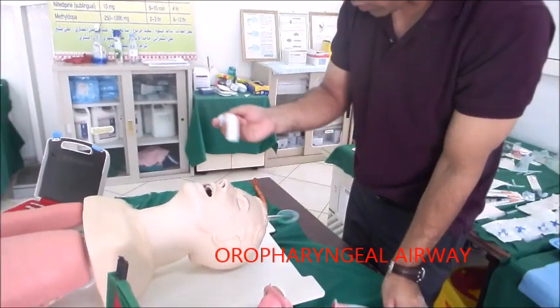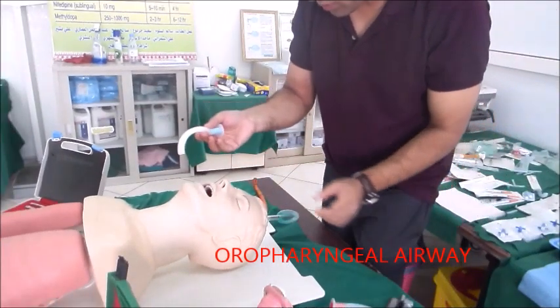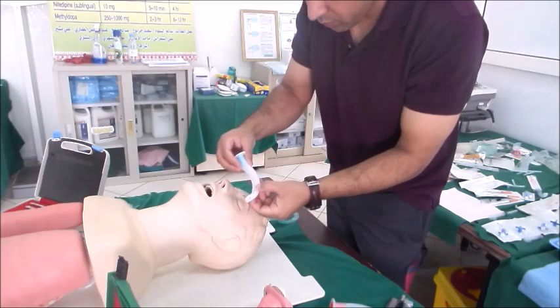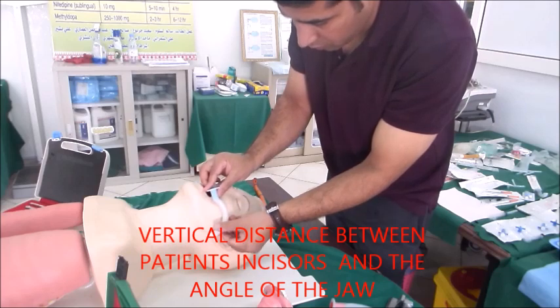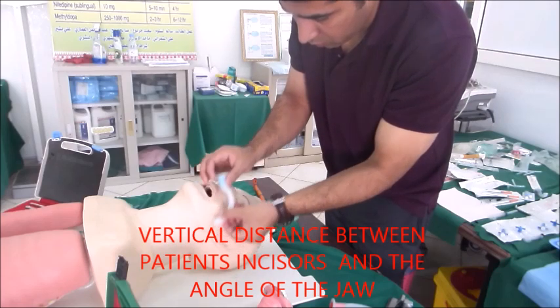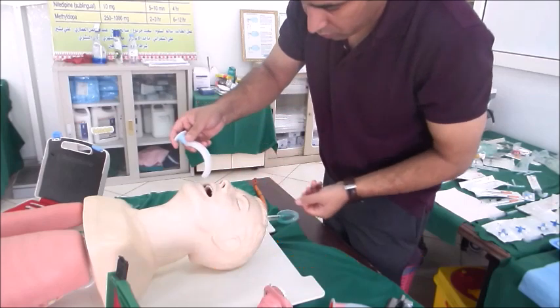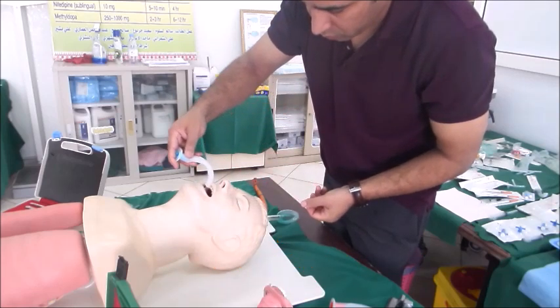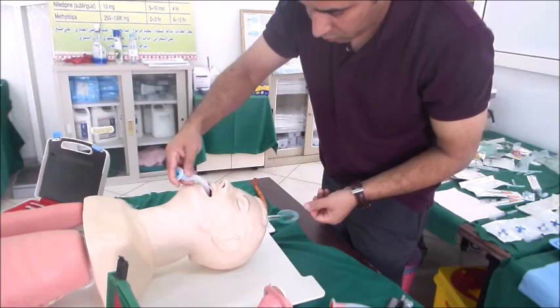For size estimation, place the flange at the mid incisors and the tip at the angle of the jaw. This is how we measure the correct size.